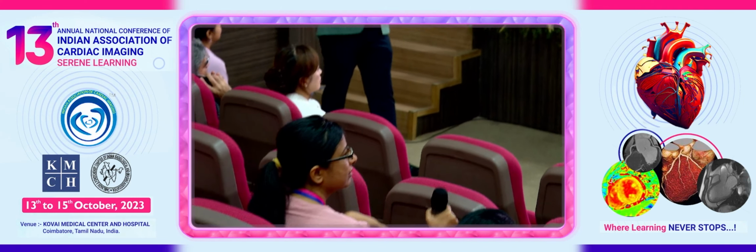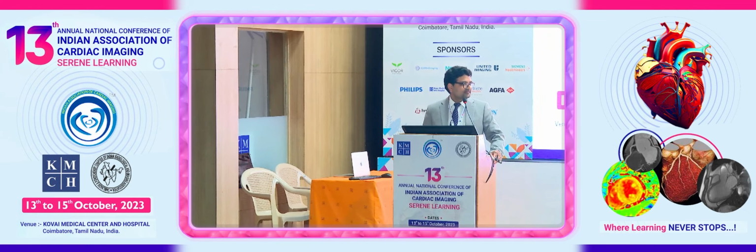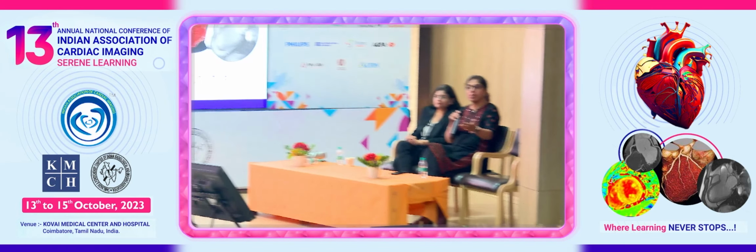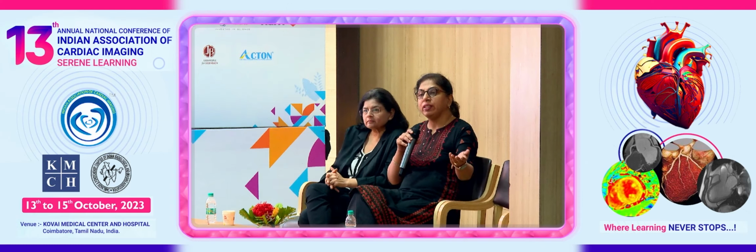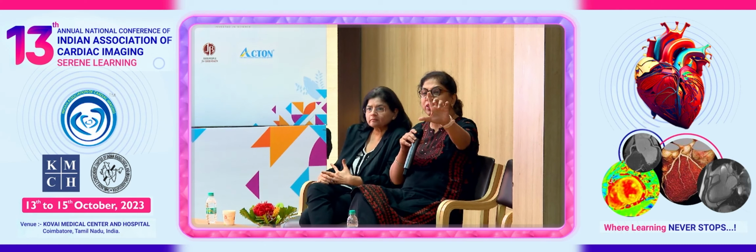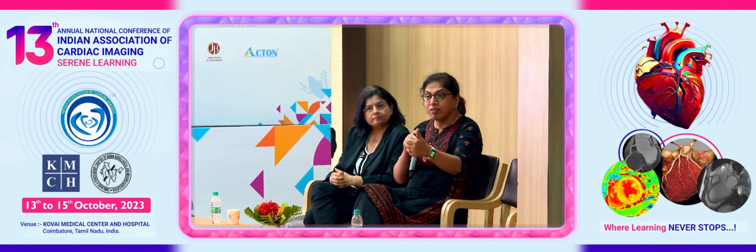Yeah, I agree. Of course, this is about software availability. No, this is true everywhere. For the TAVR, for the stent grafts, cardiologists are not conversant with the radiological images. So what they do is they get a CT done from outside, put it on a CD, and give it to the company people. He tells them to put this stent graft of this size, and they go ahead and do it, because they are not conversant with planning.